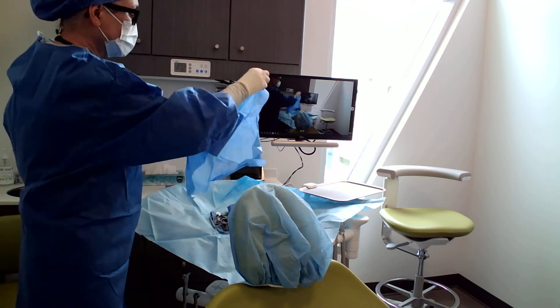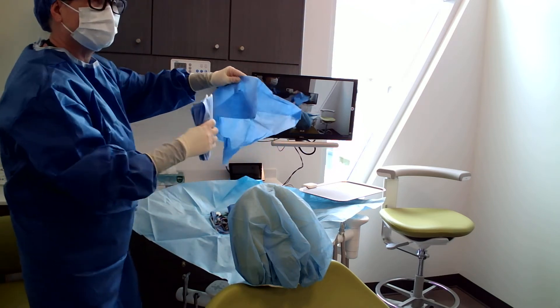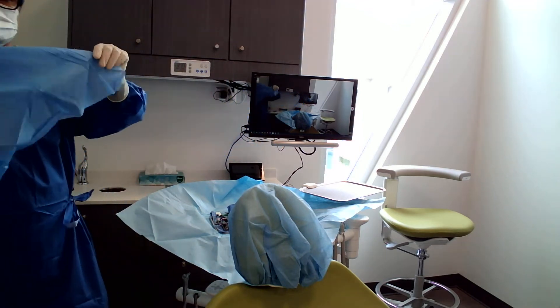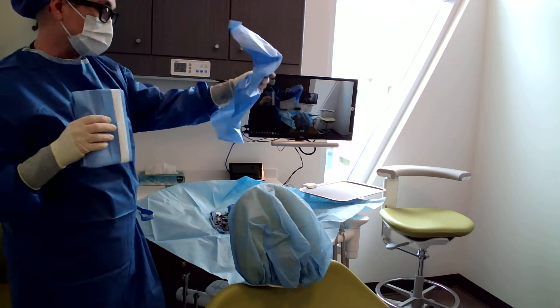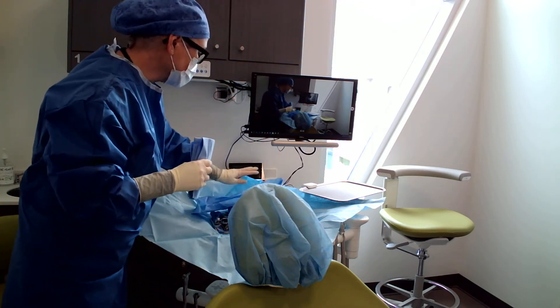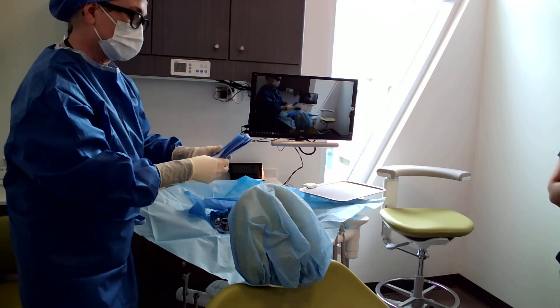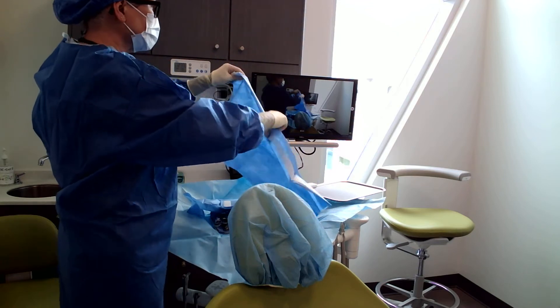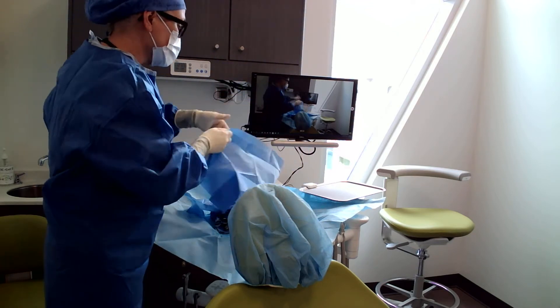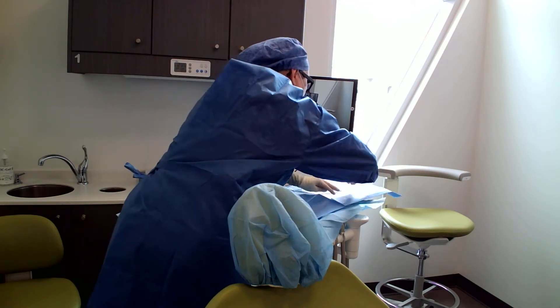These are two little utility drapes — I just love them. Grab and drop. This is sterile. This was the outside package for the utility drapes. I really like it because I'm going to cover up my instruments after, because when Courtney comes in, I don't want to scare her with all these sharp, shiny-looking items. And then this one I'm going to use to make a little more real estate on my back table for sterile items.